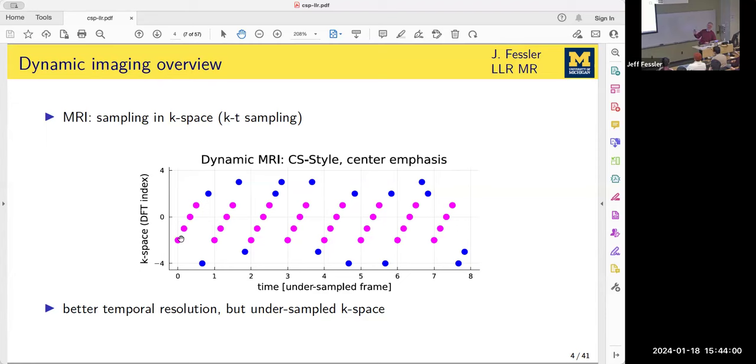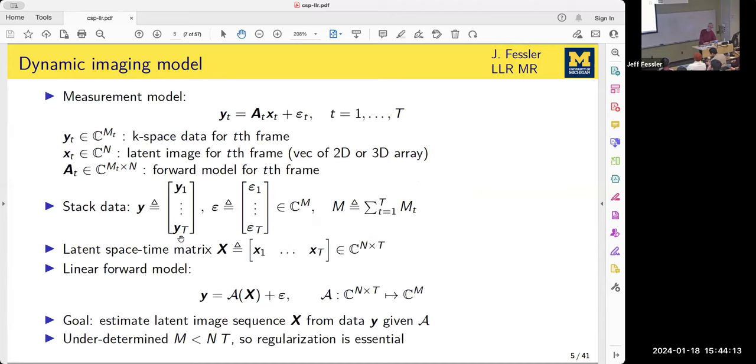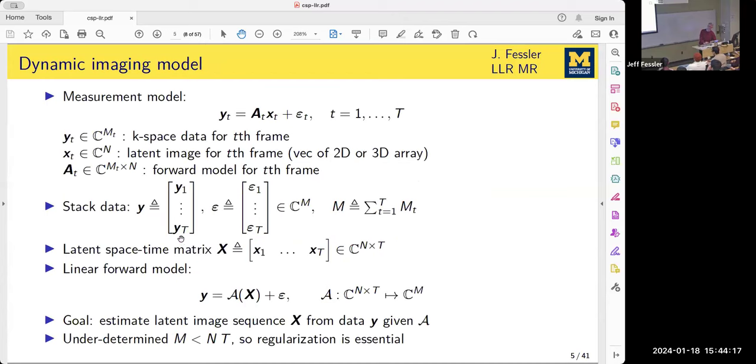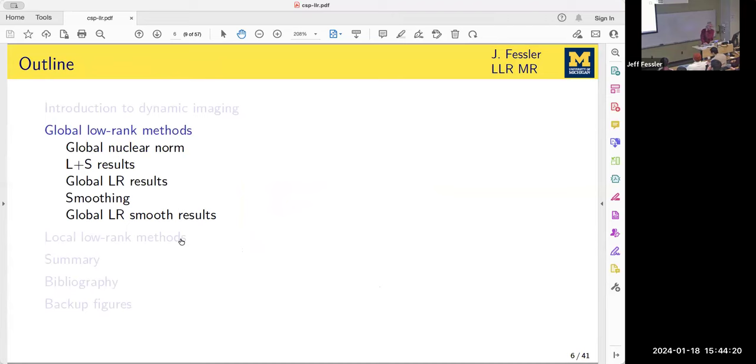So this is a great simplification of what really can be done in practice. But even when we do a spiral, we're moving around in two-dimensional, let's say, k-space, every one of those points takes time, right? So time is marching on as we're collecting the points. So it's not limited to this. It's harder to reconstruct when they're not falling on a nice grid, but we do this. That's an active area of research and has had some impact on clinical practice as well.